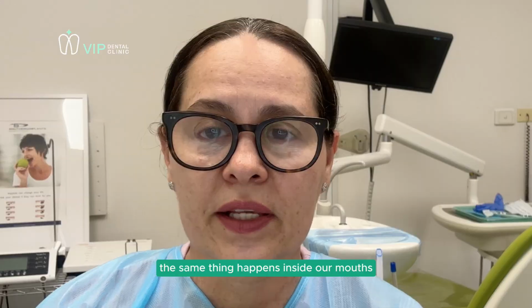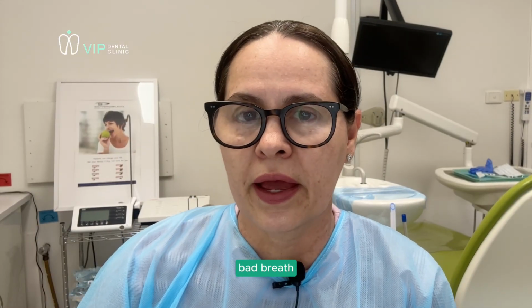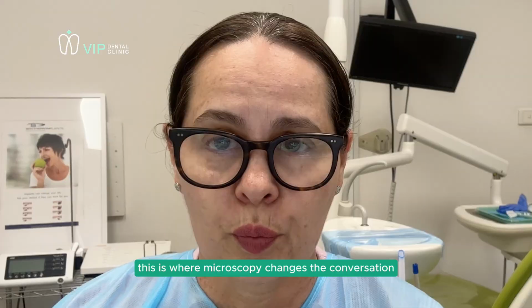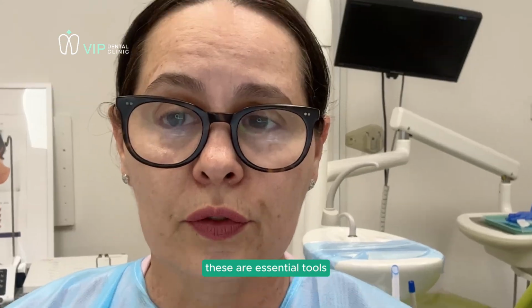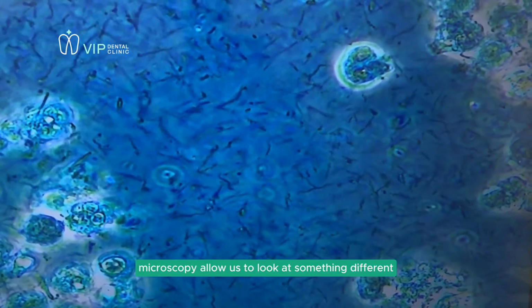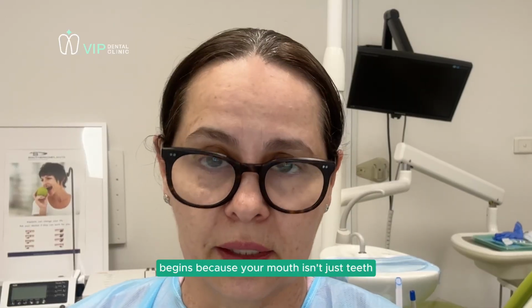The same thing happens inside our mouths. A cavity, bleeding gums, bad breath. They tell us that something has changed. But the question is, what is it? What has changed? This is where microscopy changes the conversation. Traditionally, we dentists use clinical examinations and X-rays to diagnose disease. These are essential tools, but they mainly show us the damage after it has already occurred. Microscopy allows us to look at something different. It allows us to look at the environment where disease begins.